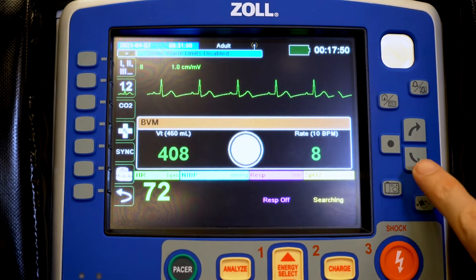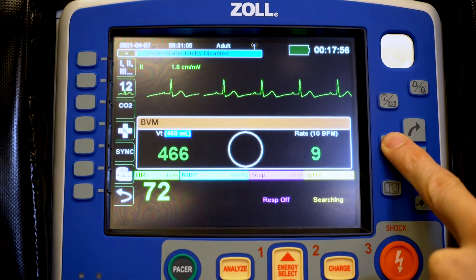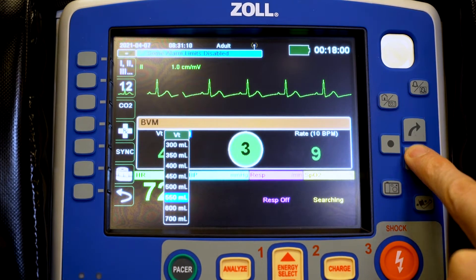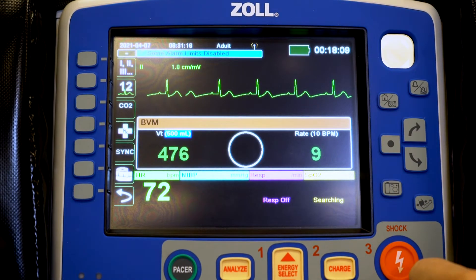If we need to make adjustments for our patient's size we have the ability to do that. For a small frail patient or a very large patient, we can adjust the volume much like we did on the ventilator at 6cc per kilogram of ideal body weight. Here we have a bigger patient and we'll adjust that to 500 milliliters.